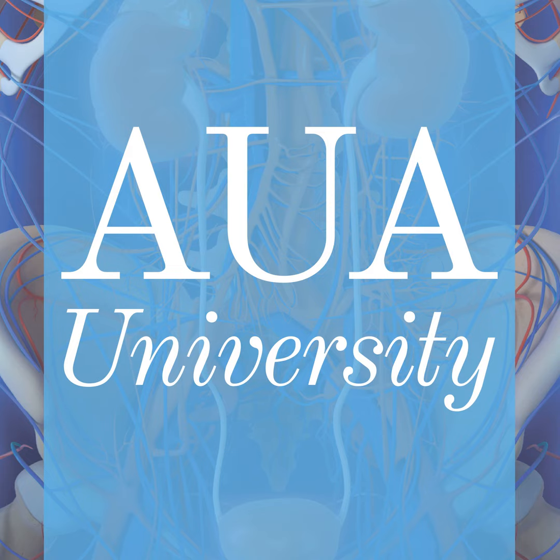So now we're just going to go into PSMA PET for initial staging and just look at some of the initial studies. And so this is the PRO-PSMA trial. There were 302 patients with unfavorable risk prostate cancer who were considering curative treatment. And they were randomized from 2017 to 2018 to undergo initial staging with conventional imaging versus PSMA PET. And then following initial imaging, all patients crossed over to be staged with PSMA PET or with conventional imaging.